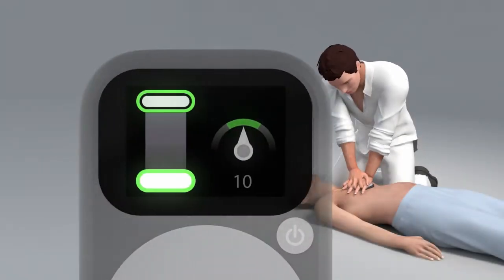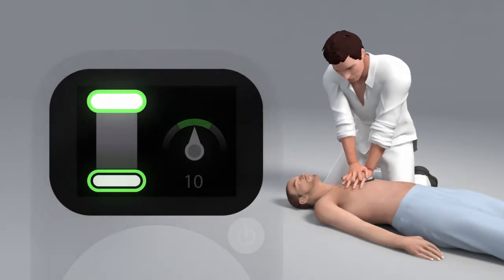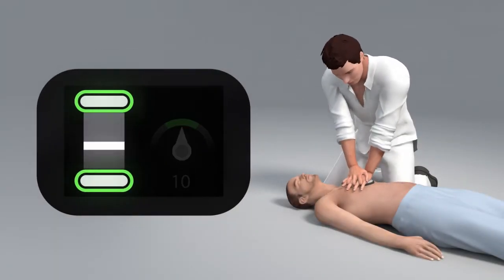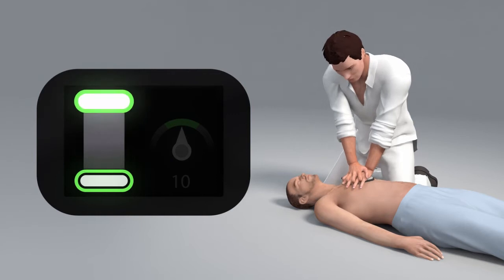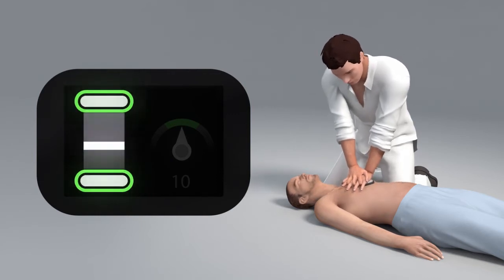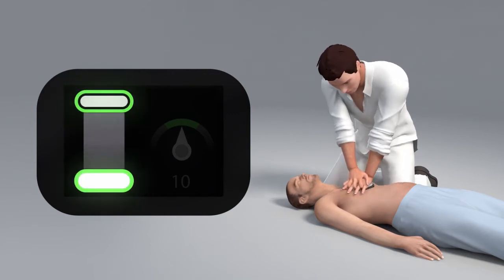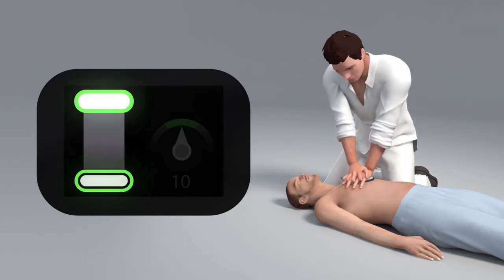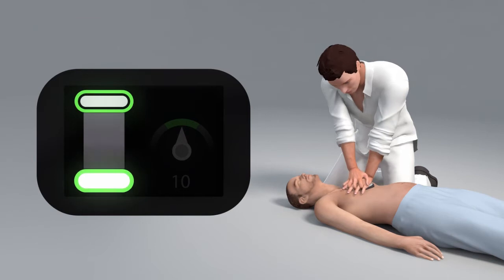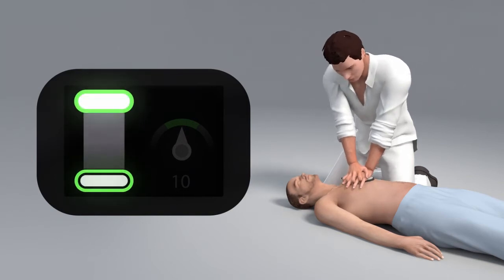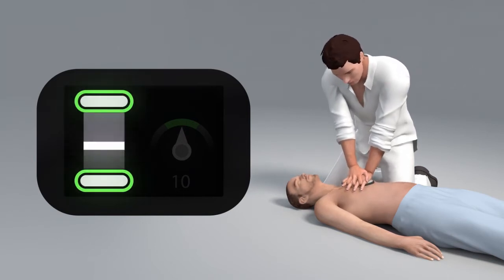The depth indicator is on the left of the display. It indicates your achieved compression depth and release. Each of your compressions is represented by a moving white bar.